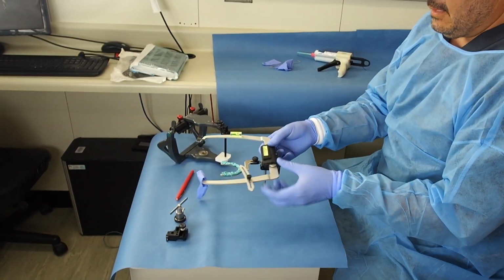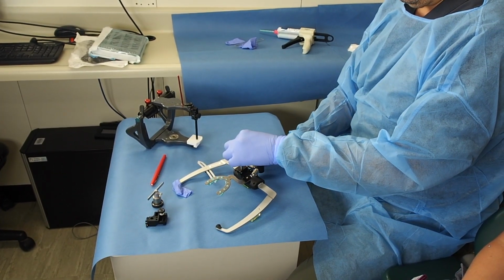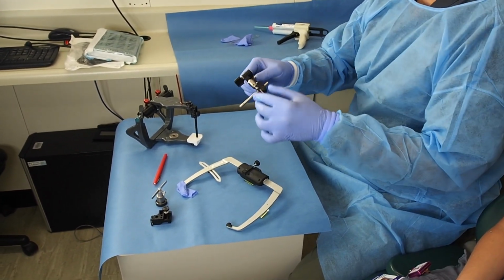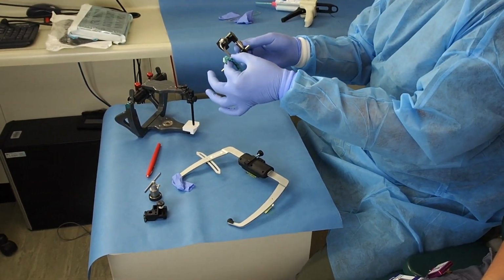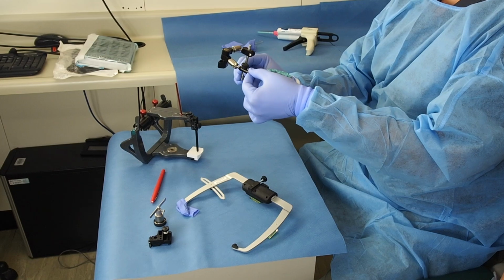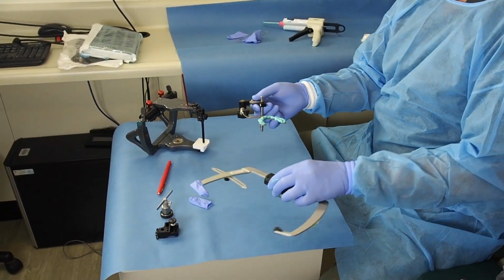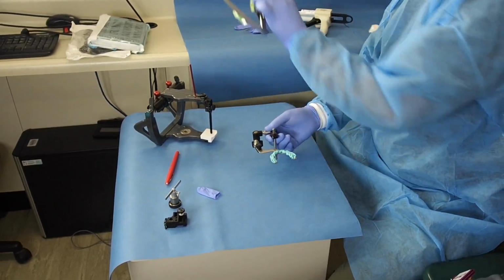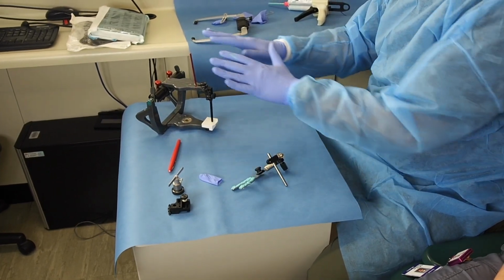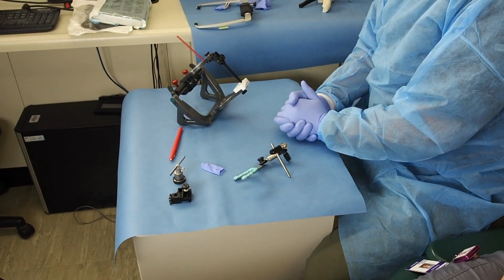Once I have this, I'm going to flip it over and detach the articulated arm, right? This is nice. You have to make sure it's nice and secure. If this, for any reason, is moving, you have to retake the Facebow again. The Facebow goes back into the box, and now it's time to put it onto the Denar Mark 320 articulator.